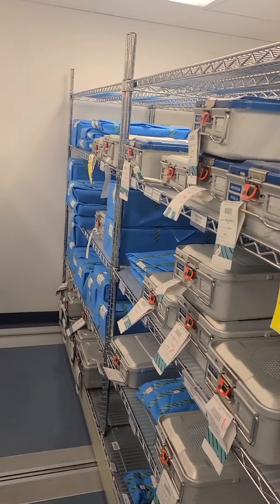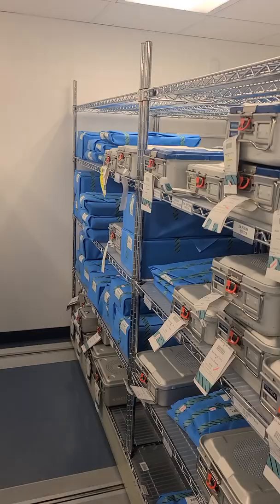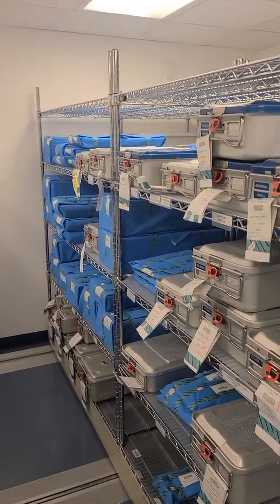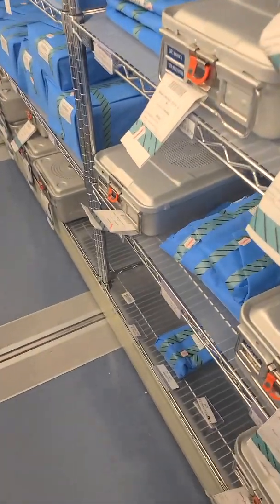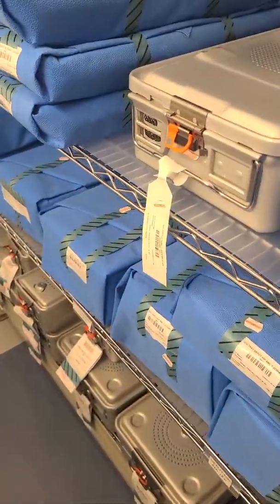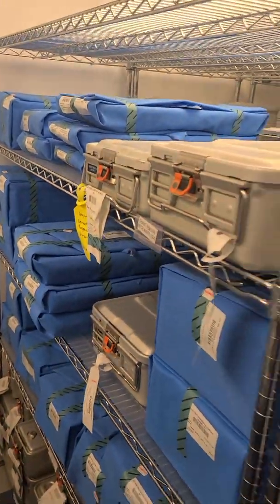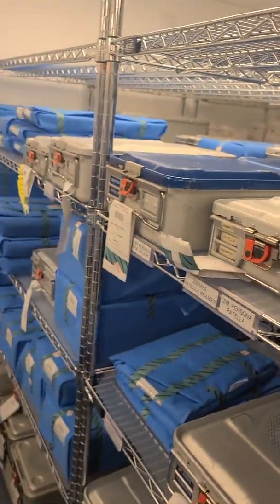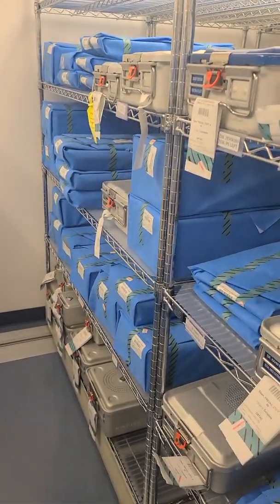If you're using an open racking system, as we see right here, the shelving should have some kind of lining, especially the bottom shelf. The bottom shelf should be solid for cleaning purposes so that dirt doesn't kick back up when you're cleaning.